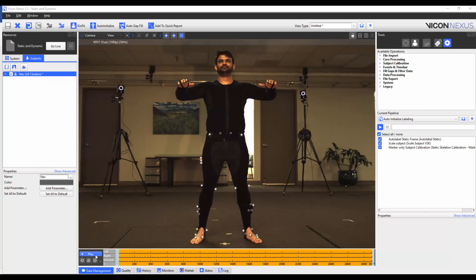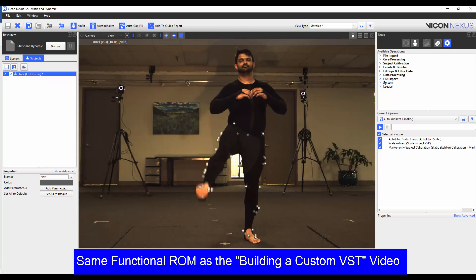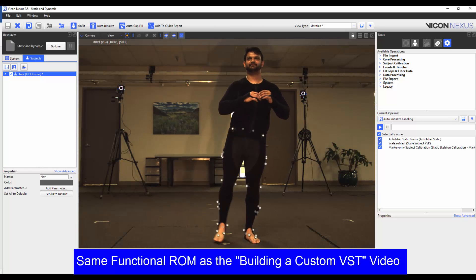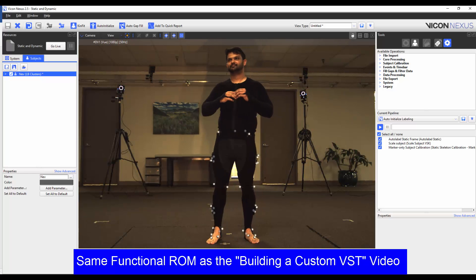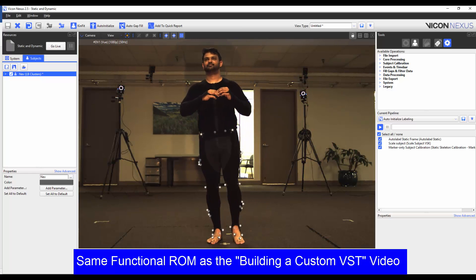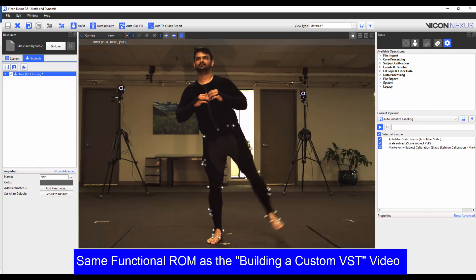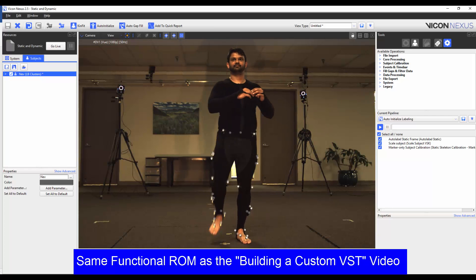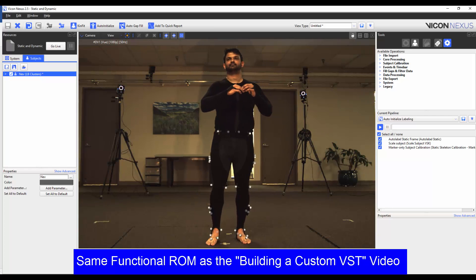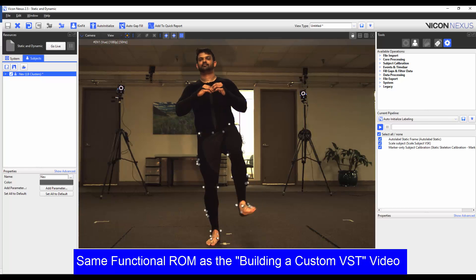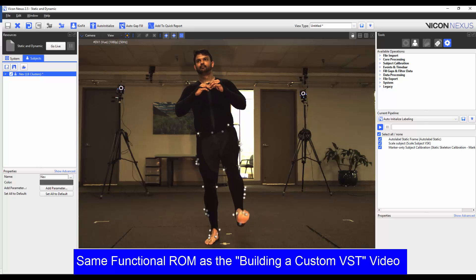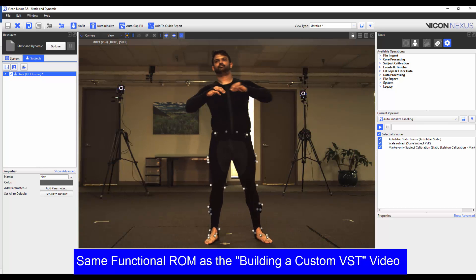In this video, I have captured a trial where my subject starts off in the base pose and then goes through the functional range of motion, where the subject performs the star pattern with both hips, flexes and extends both knees, rotates the ankle joints and then returns to the base pose.